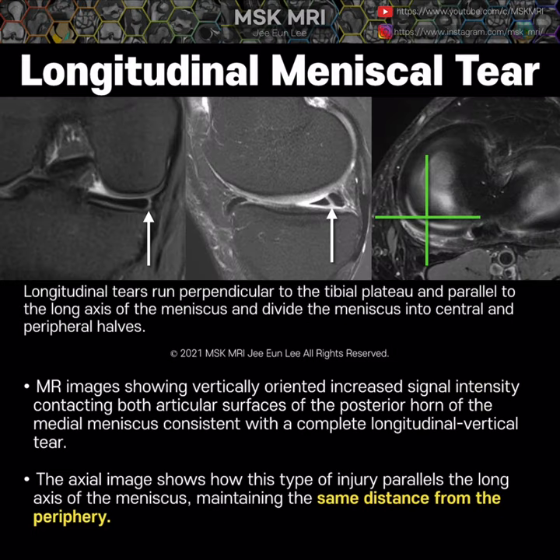While this case demonstrates a vertical-oriented high signal intensity line contacting both articular surfaces, indicative of a complete longitudinal vertical tear.